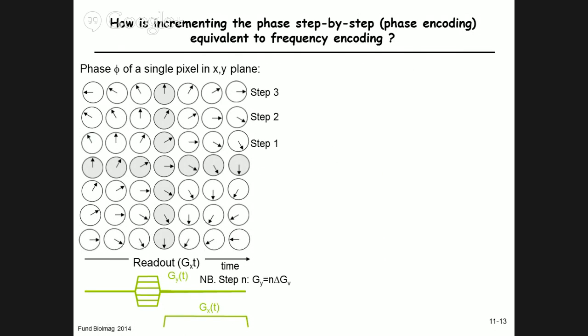So what we're looking at on the horizontal axis is the position, the phase of the magnetization vector with time during which one records the signal. On the vertical axis is what we have filled into the matrix in the computer after digitization, each time after the y gradient has been incremented or decremented from this value to this value. That's going from here to here.